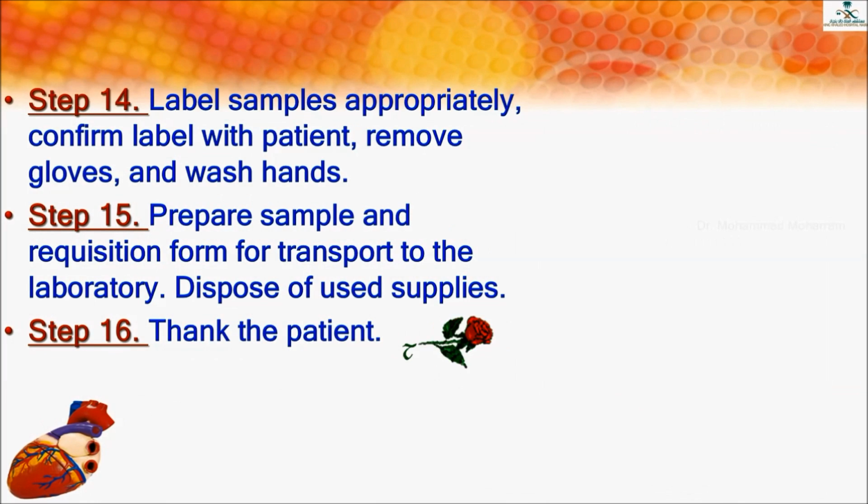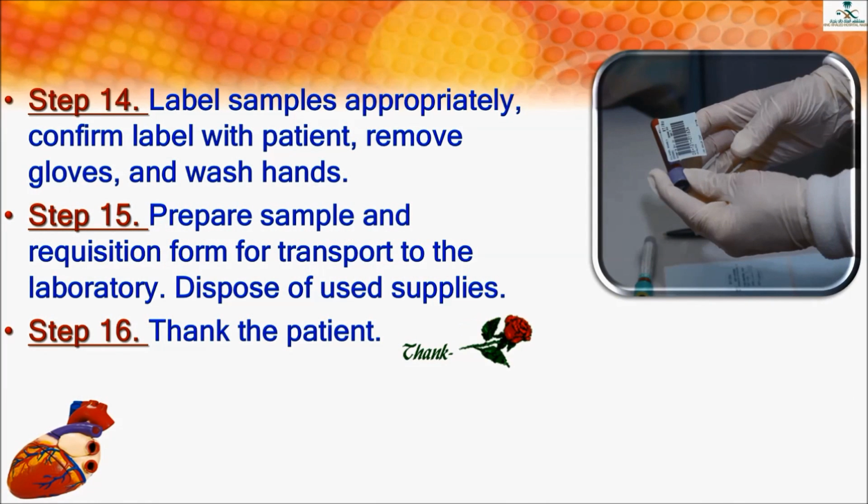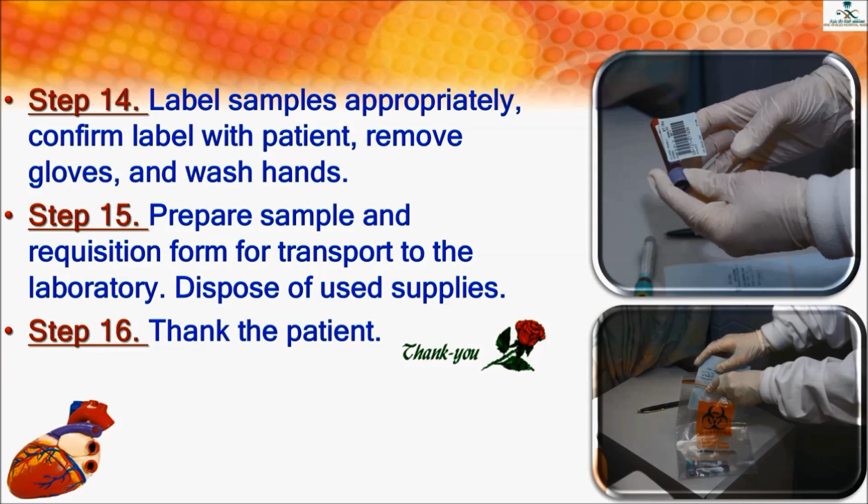Label samples appropriately. Confirm label with patient. Remove gloves and wash hands. Prepare sample and requisition for transport to the laboratory. Dispose of used supplies. Thank the patient.